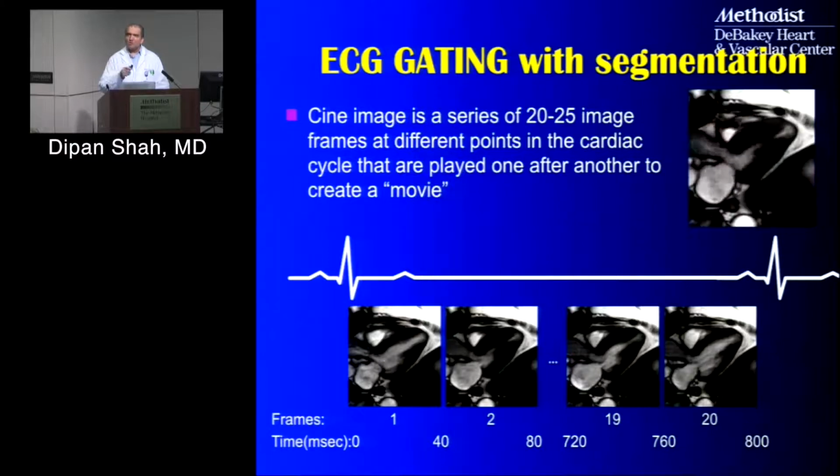And there's two ways you can think of temporal resolution. You can think of it as the milliseconds per frame, or you can think of it as the number of frames per second. And they're really just interrelated. So what is it for echo? 30-something? So echo is probably about 25 to 30 frames a second, right?